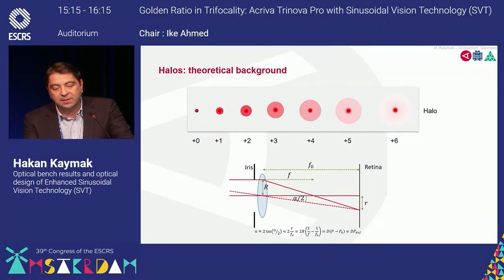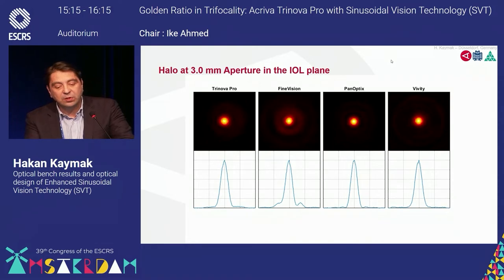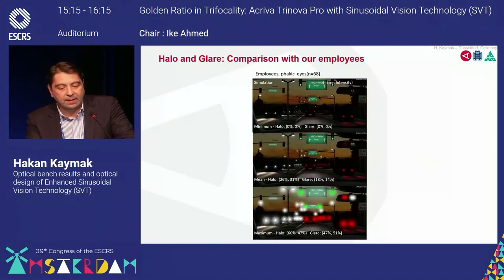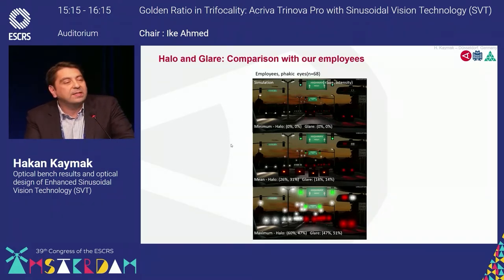Not the size, it's the intensity. And we can play with this, and this was done with the Trinova Pro. As you can see here, this is the halo and glare measurement, and you see there is no intensity for the halos with the small pupil and also with the greater pupil. So, looking now at the halo and glare, when we compare it with our employees, you see there's not a big difference with the normal halo and glare, and when we check it here with the Trinova Pro.